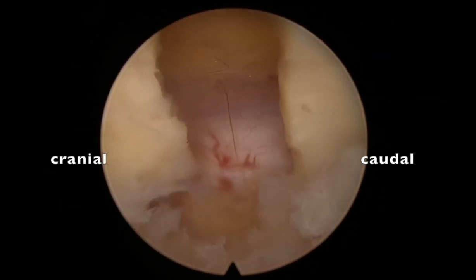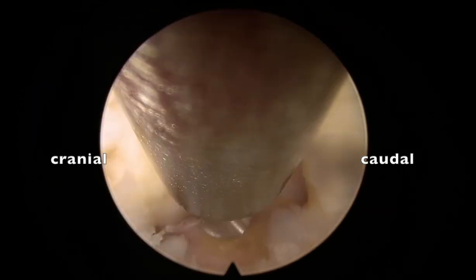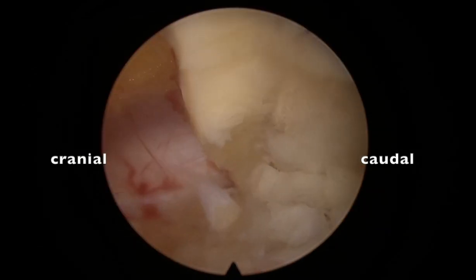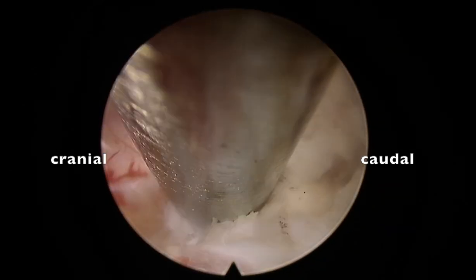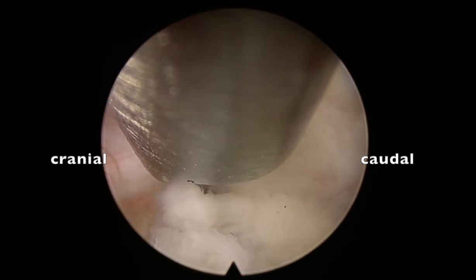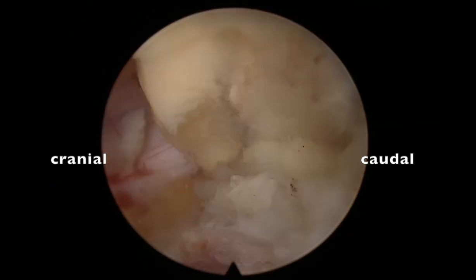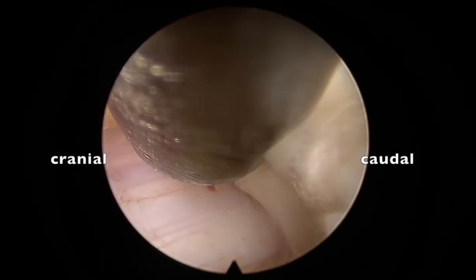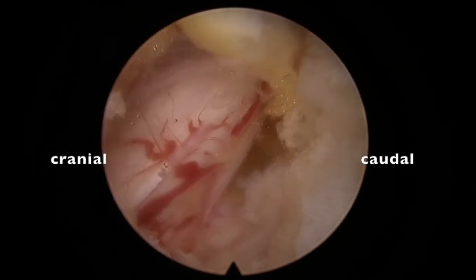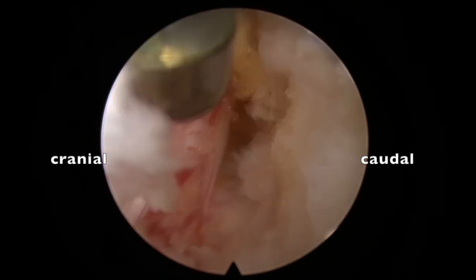Before exposing the epidural space, bony work should be done correctly — this comes with experience. Always do the bony work before opening the yellow ligament. Once the yellow ligament is open, remove the ligament in the lateral recess from the upper laminar to the lower laminar edge. Here I'm removing the ligament towards the lower laminar edge. Now I completely expose the root.